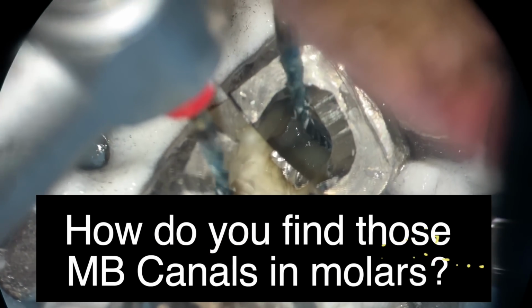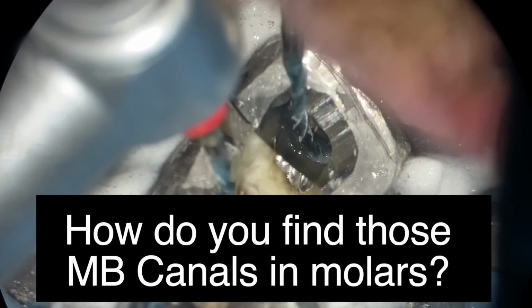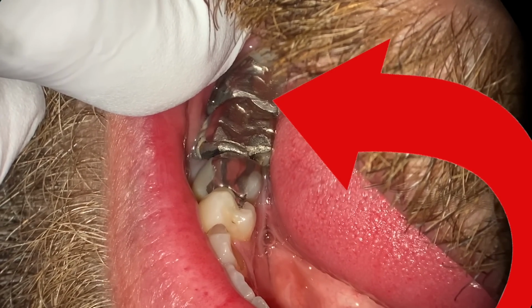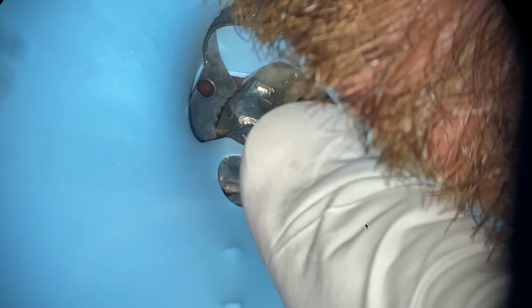Today I'm really excited about this video because it's going to be talking about trying to find, in this case anyways, the mesial buccal canal, and a couple of tips. You know, it's really difficult to find these canals sometimes, and look at the size of that amalgam.